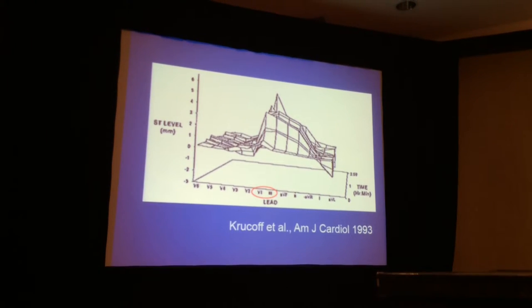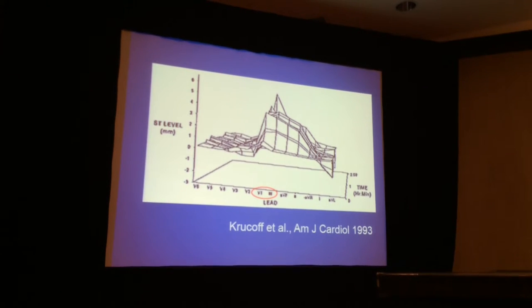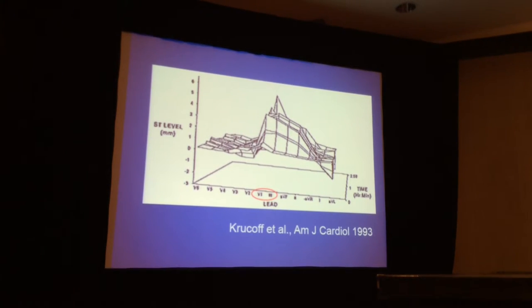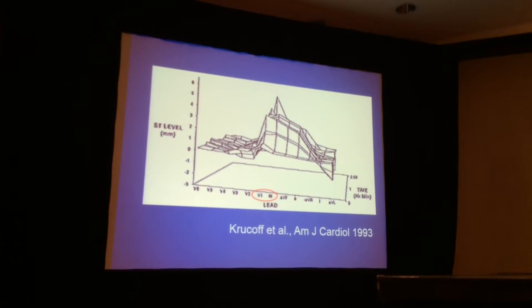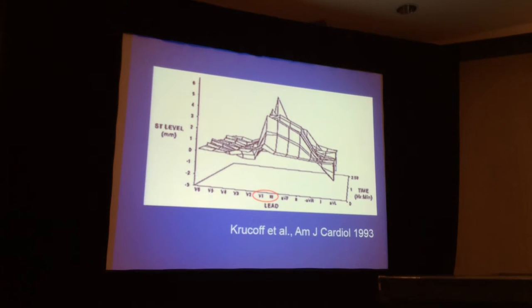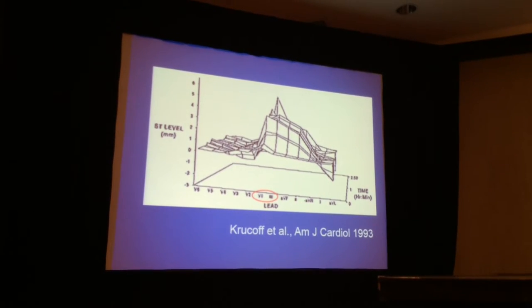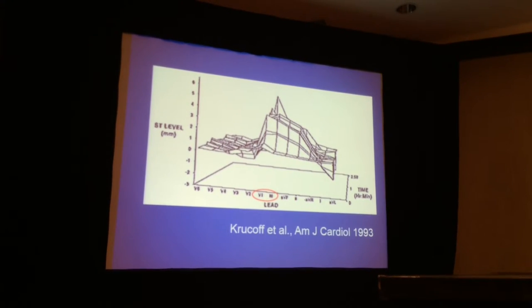Oh no, I think you said, did we use minus AVR? I don't remember what you said. Yeah. And so, remembering, but yes, as you can see, Jim did use minus AVR, as you would need to do if you're really going to have things orderly. So this was a move from just showing the orderly sequence in one plane that we all were familiar with to the orderly sequence in the other plane that only those in Sweden had been familiar with.